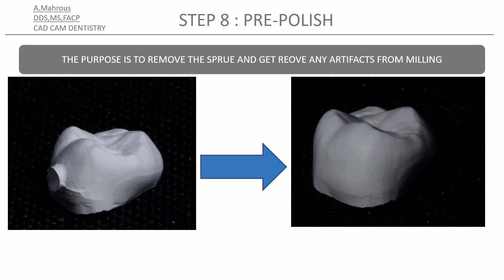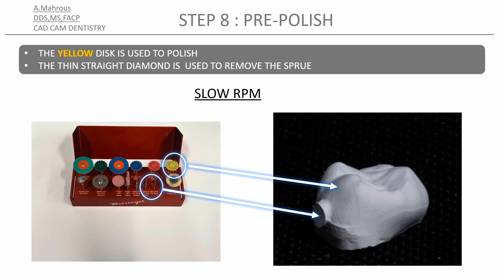The next stage is pre-polishing. That involves removing the sprue and removing any extraneous milling marks, plus bringing the surface of the crown to an eggshell finish. The first thing you'll do is use the same burr you used to separate the crown from the block to remove the sprue and remove any milling marks on the surface of the crown.